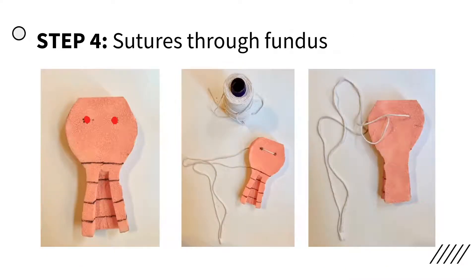Poke two holes in the fundus of the uterus. These holes should be one inch from the top of the fundus and spaced one and a half inches apart; they are indicated by red dots in the photo for better visualization. Cut a piece of twine approximately 40 inches long, then thread the twine through the holes made in the fundus. The free ends of the twine should be extending out of the anterior side of the uterus.